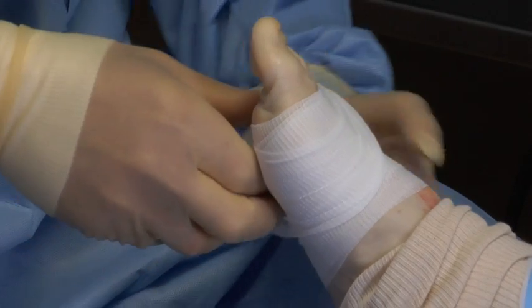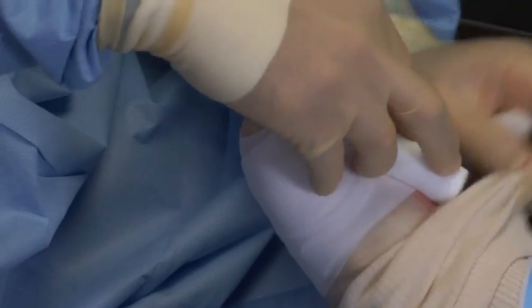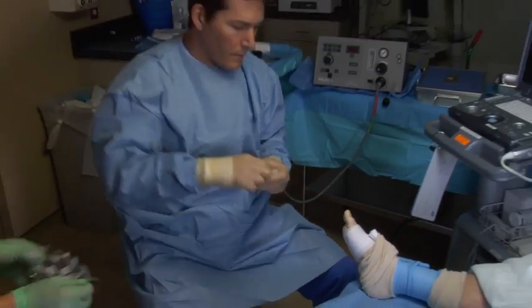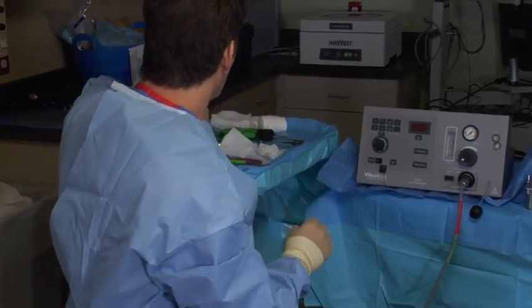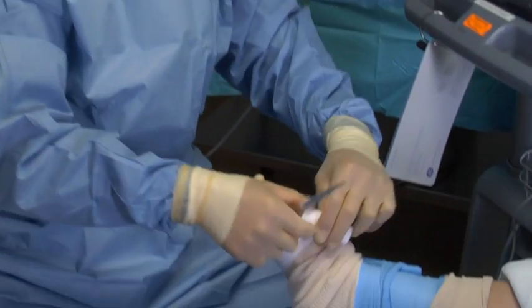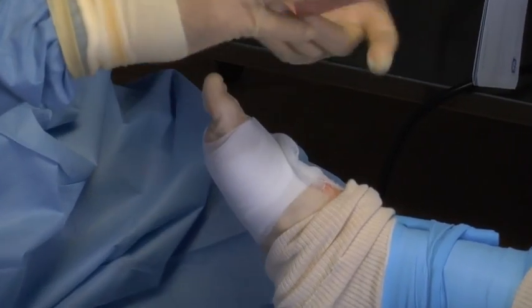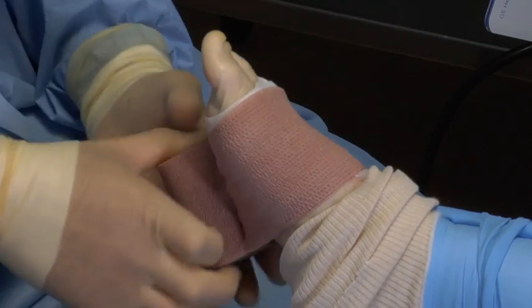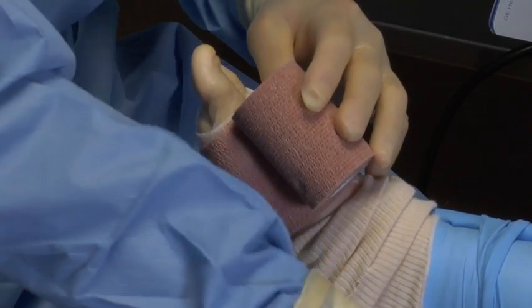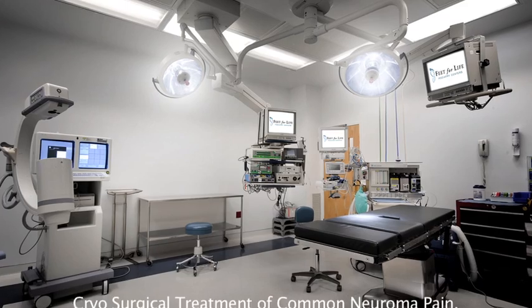Now we're dressing the patient with the compression dressing, and she'll wear that for approximately 24 hours. And the next day she's up and she's able to get on the foot and actually even take a walk or go for a short hike after this procedure, which is absolutely amazing. And that's why we like the cryosurgical treatments much more than the cutting procedures that have historically been performed.